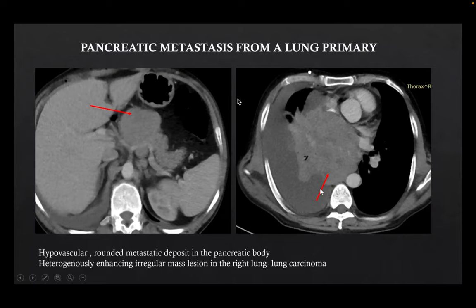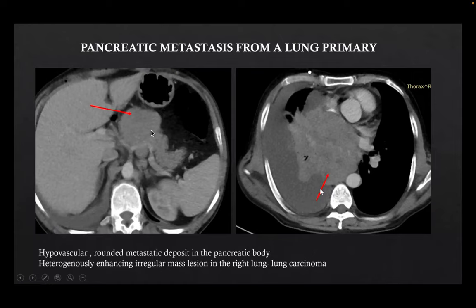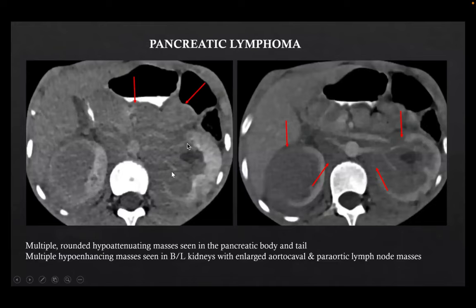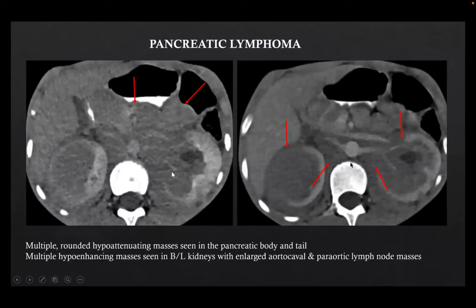This was a case of pancreatic metastasis from a lung primary source. We can see a heterogeneously enhancing irregular mass lesion in the right lung on the right picture, and on the left picture, hypovascular rounded metastatic deposits in the pancreatic body. This was a case of pancreatic lymphoma where we can see multiple hypo-enhancing masses in the pancreatic body and tail on the left picture, and on the right picture, multiple hypo-enhancing masses in bilateral kidneys with enlarged aortocaval and para-aortic lymph nodes.